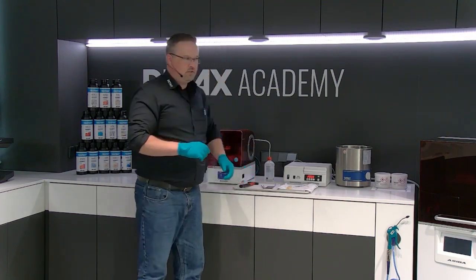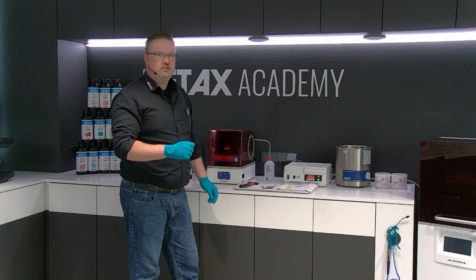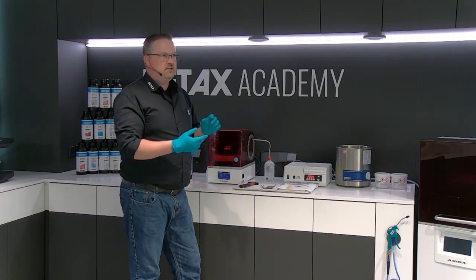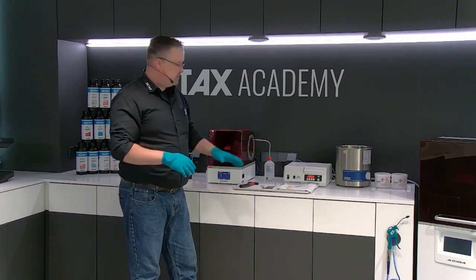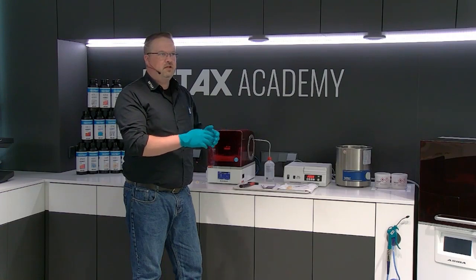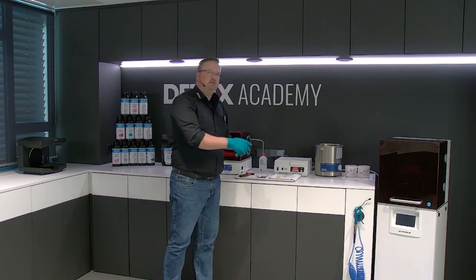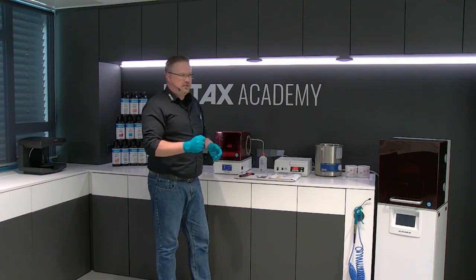One of the questions was about material from other manufacturers in the market. What is the big difference to the others? We have a lot of difference in mechanical parts, abrasion, and so on. The biggest difference is we don't need any Q-tips. We don't need any alcohol tissues. We don't need any other materials or tools to clean the surface and to clean the area between the supports. We only need a little bit of compressed air.